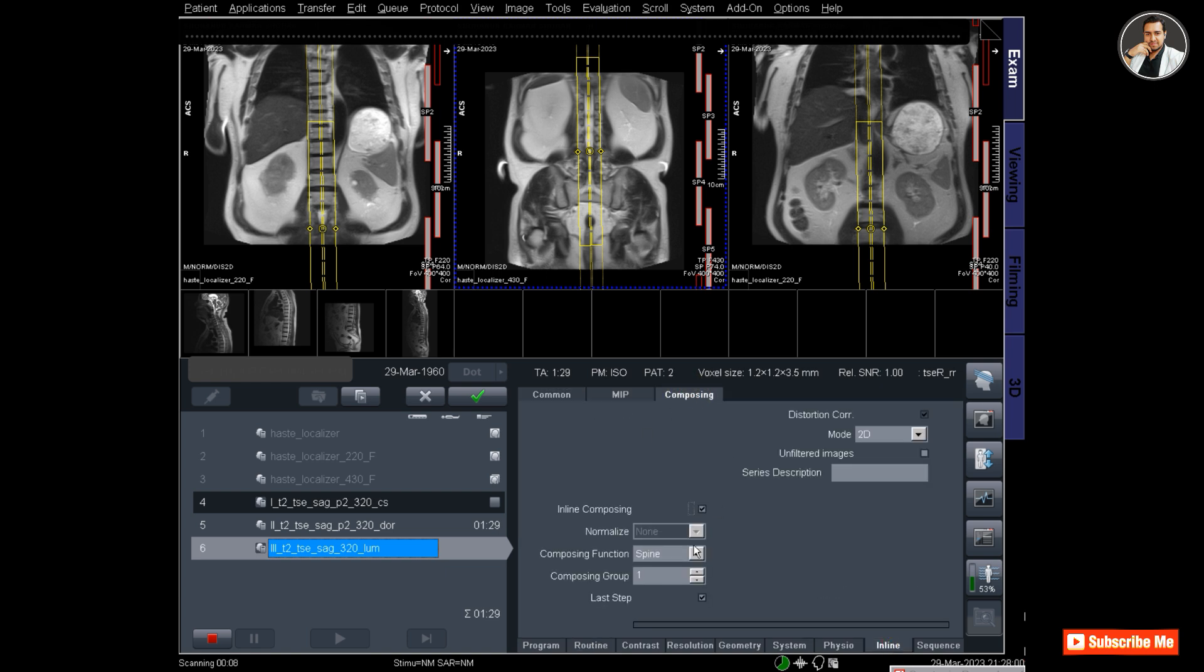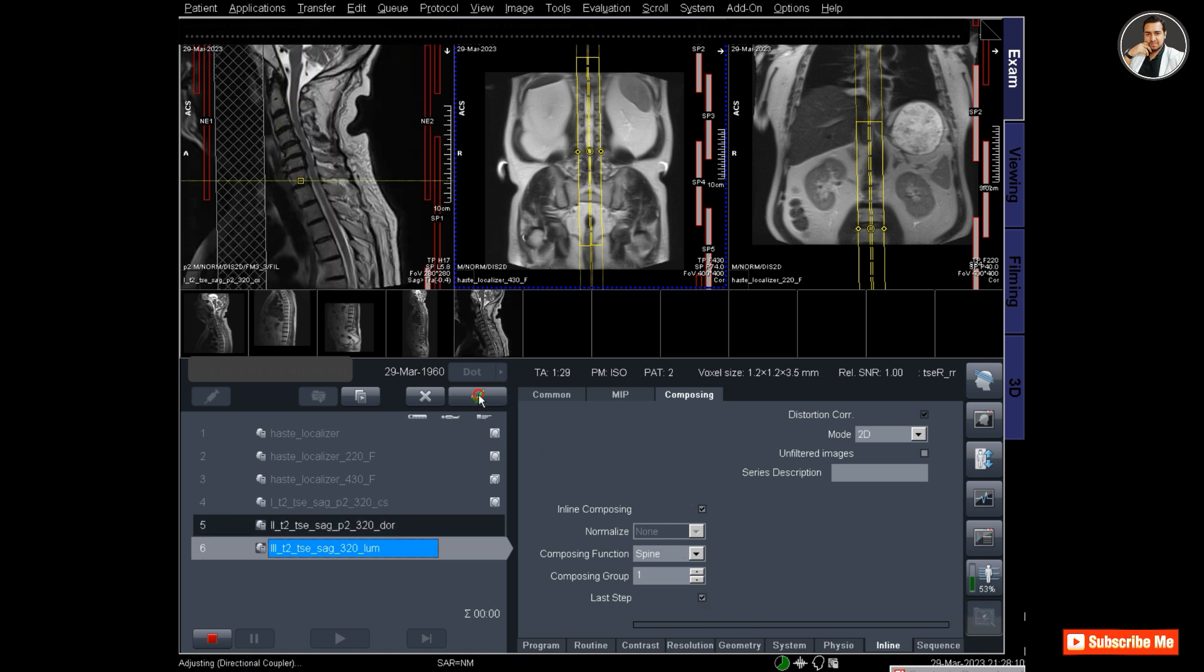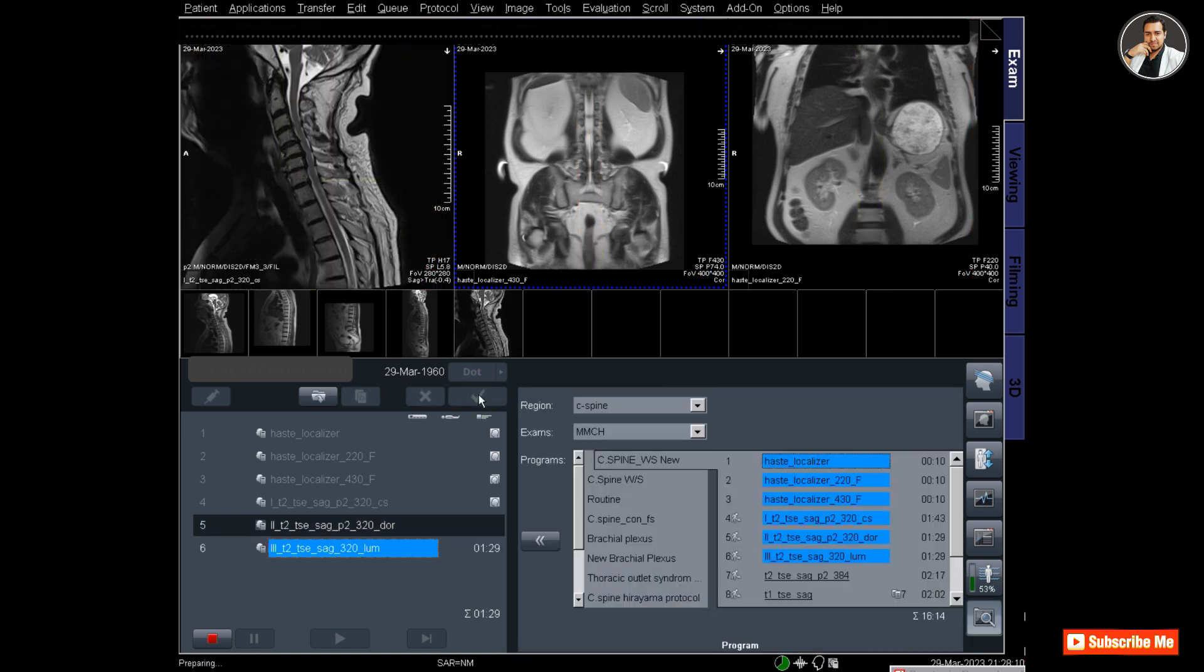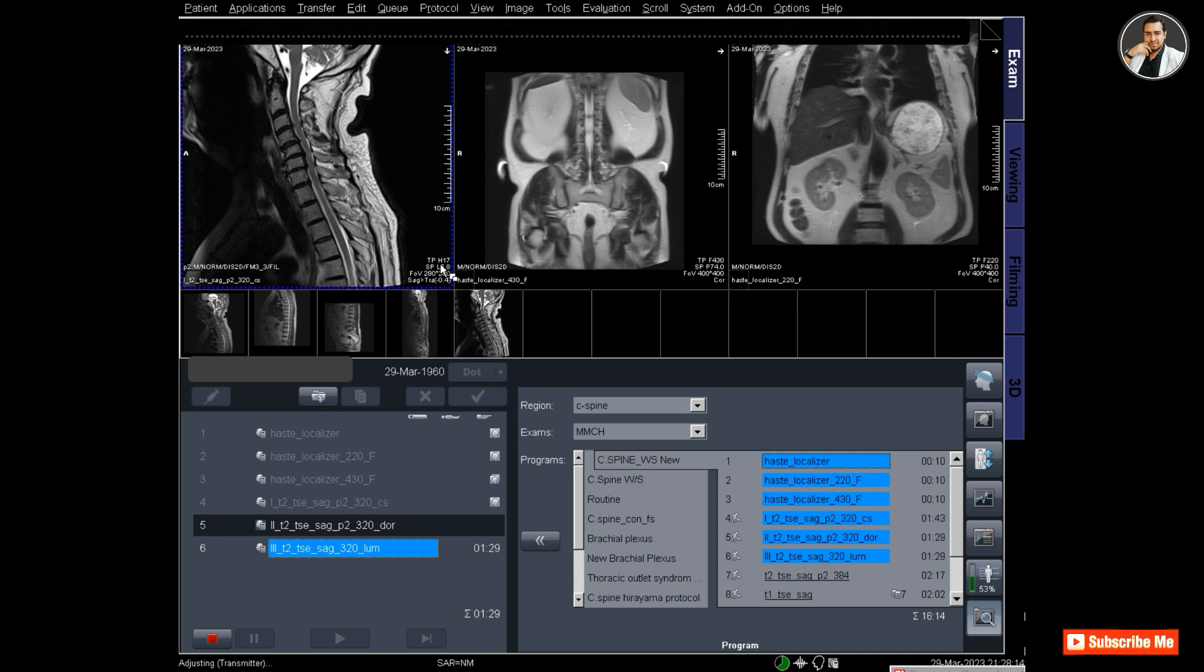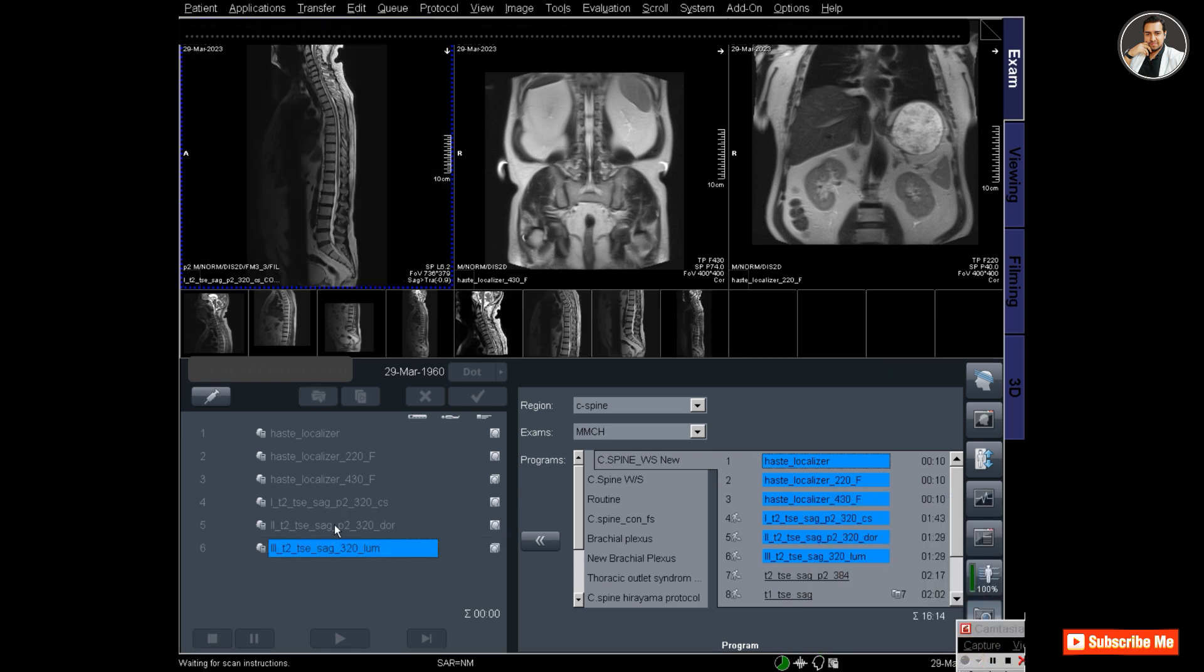The last step should be tick-marked so that the software can understand that this is the last step and these three sequences should be composed together.